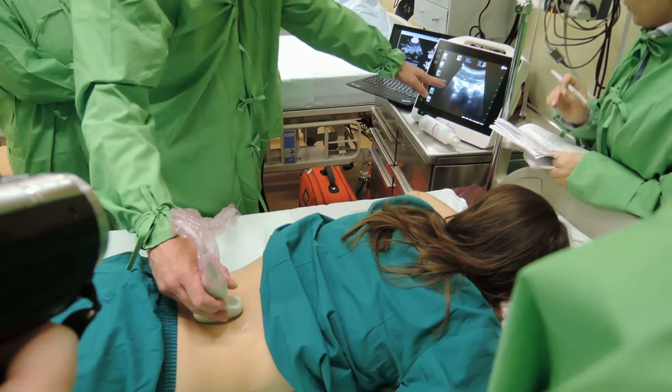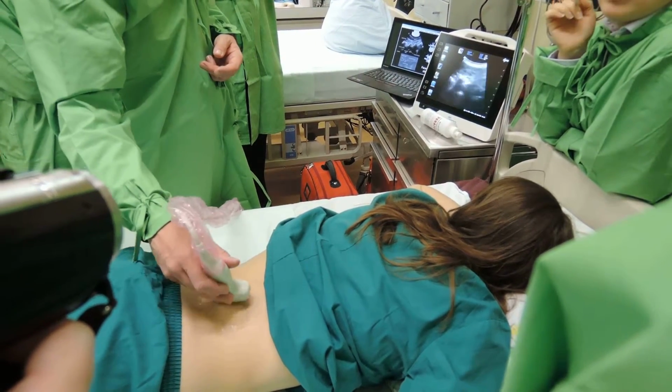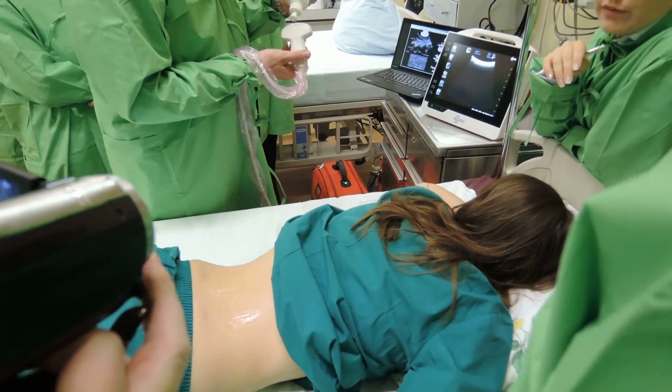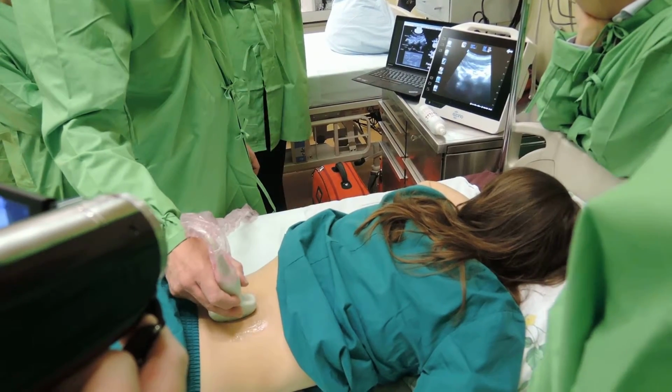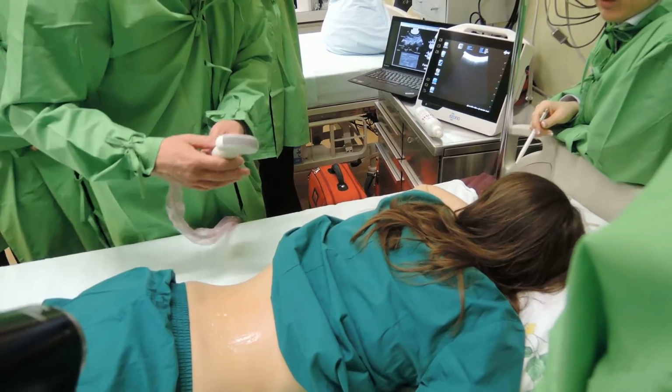Ultrasound also allows us to determine the level, if we would like to know which lumbar vertebra it is. How do we count vertebrae on ultrasound? We just move caudally. We shift caudally. There.